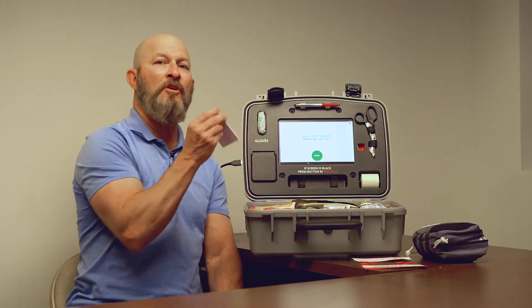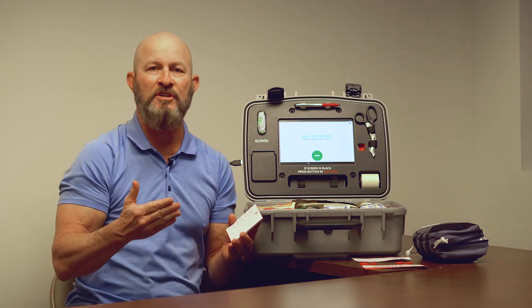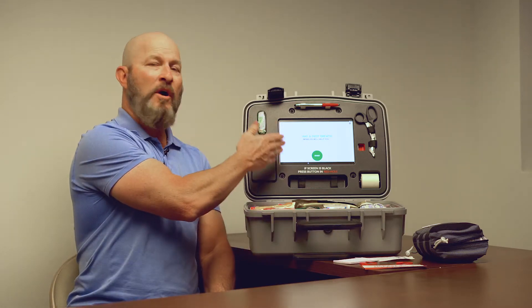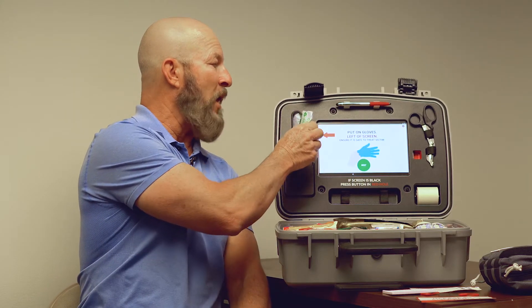First thing I would do is grab the notepad and the pen that comes with it. One of the most important things we can do is find out who the victim is and if they have any other medical issues that the rescue personnel need to know about. Once we have that, we now have it logged. The screen says, take a deep breath. When there's an emergency, our heart rates are elevated. We want to do what's right and get help to the victim as soon as we can. Hit the start button and it will tell us to put the gloves on, which are conveniently located right where the red arrow points. We open up this bag, put our disposable gloves on, and move on to the next process.